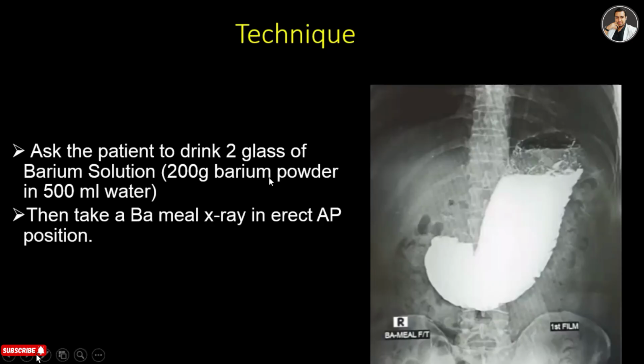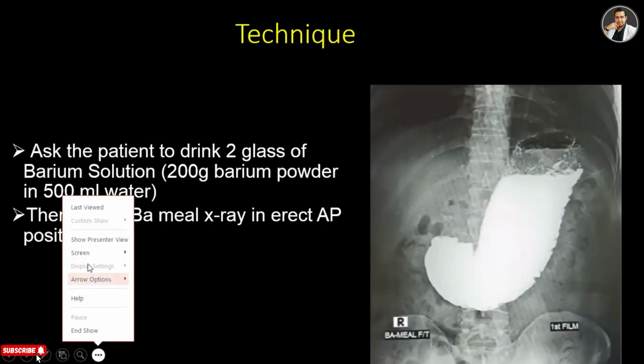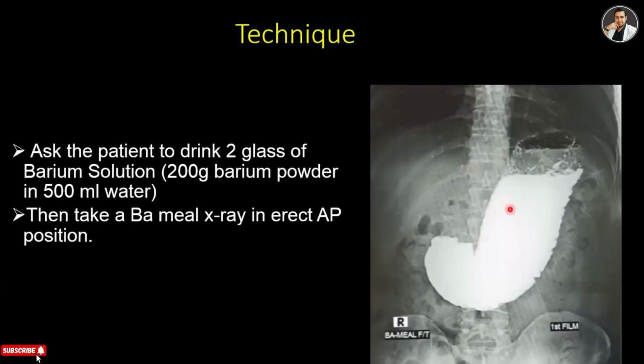So you can see there is an image of a barium meal X-ray of the stomach, and the stomach is filled with the barium solution. This is the barium meal image after drinking the barium sulfate solution.